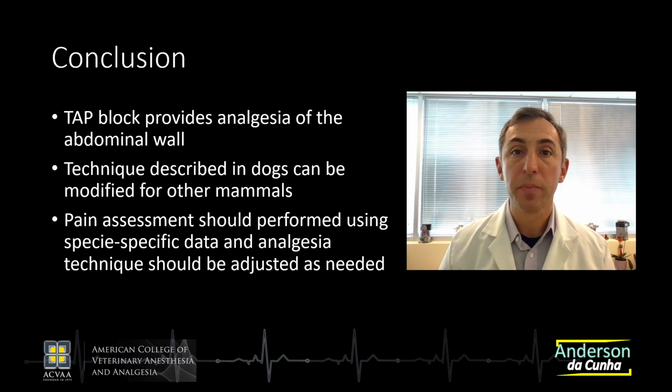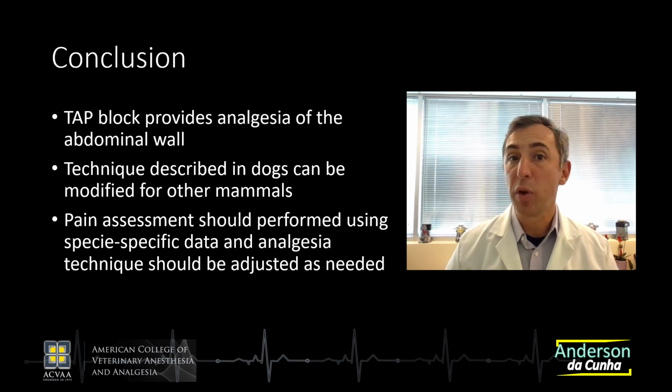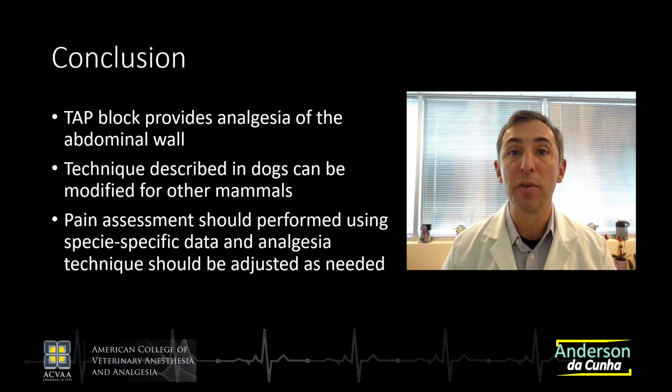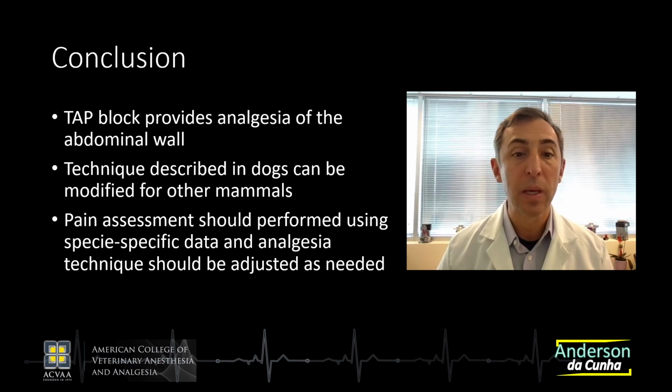In conclusion, this is a very easy block to be performed. The only disadvantage here is that you have to have that specialized linear probe that can be challenging. However, if you have that, I believe you can apply this technique for many different species. The TAP block will provide analgesia for the abdominal wall, not for the internal organs. So it's important to realize that.